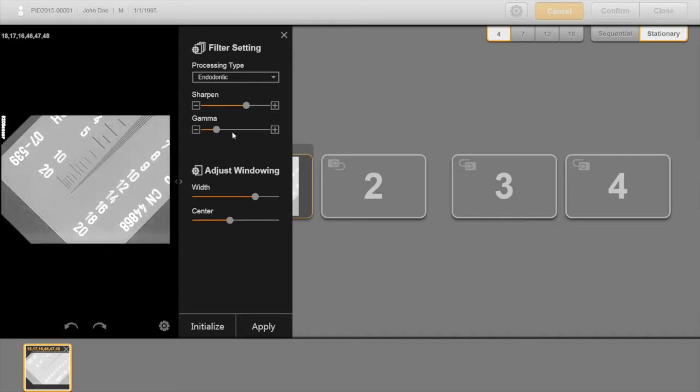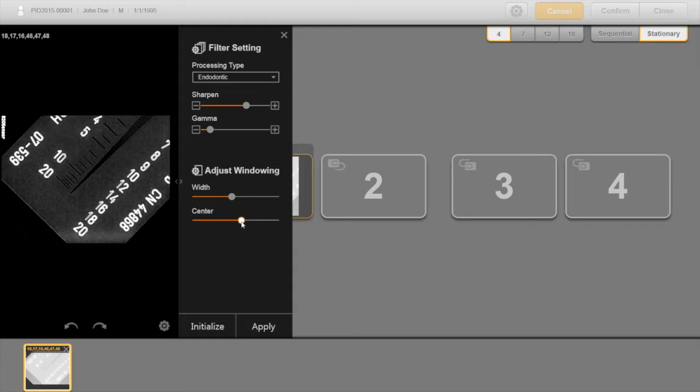The gamma button is similar to a standard brightness adjustment, but it is a more powerful enhancement. Gamma dynamically changes image pixels so that there is always a relative brightness difference between them. This ensures the changes in density within the image will be maintained, as opposed to all pixels becoming white or black.